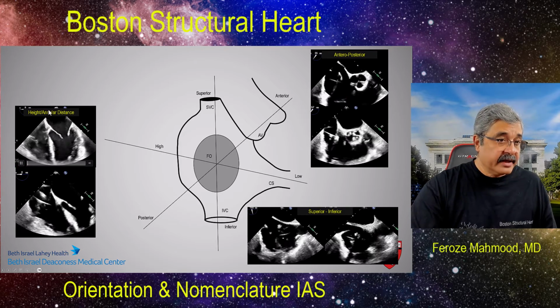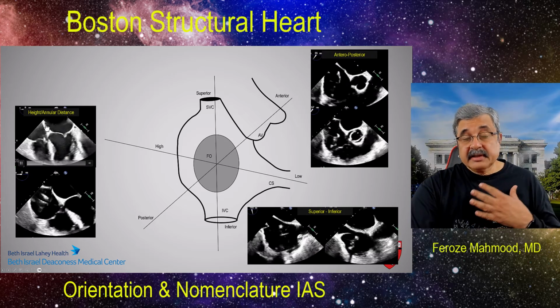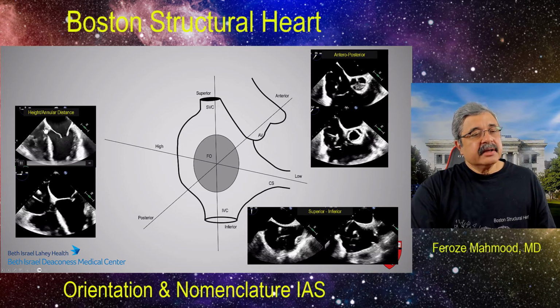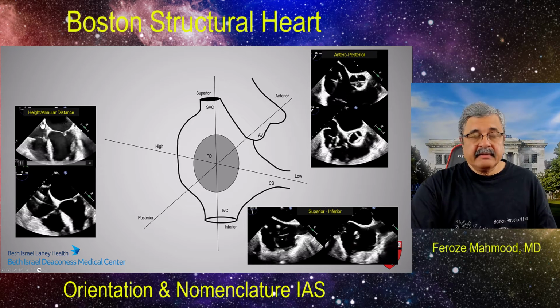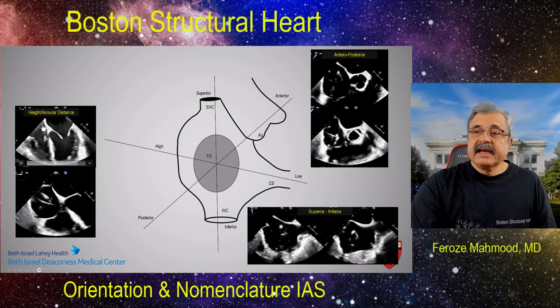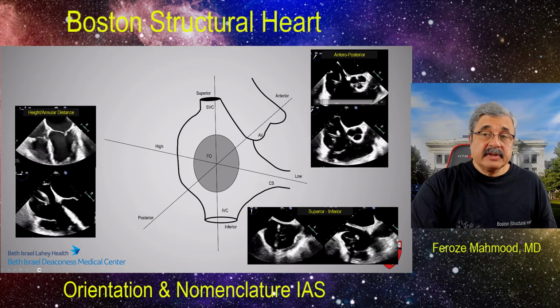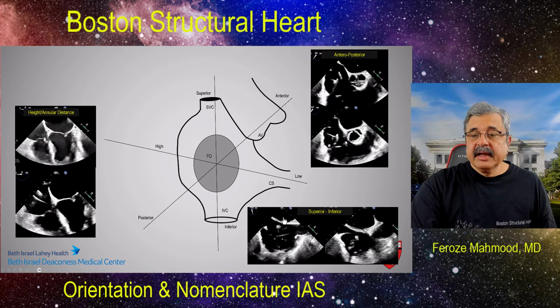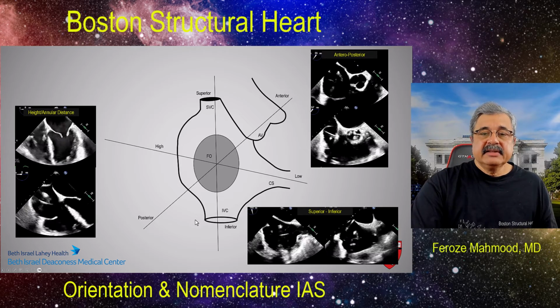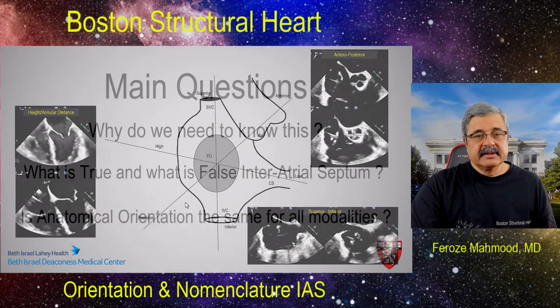We tend to call this the height of the septal puncture, but I would propose that the correct terminology, which does not have any ambiguity, should be the annular distance of the septal puncture, so that we do not have any terminology debate or confusion of what we exactly mean by this. So the anterior and posterior should be referred to as the aortic and the posterior margin, and this should be the SVC and the IVC margin, which are seen in these sections and shown with these graphic displays on this fossa ovalis.